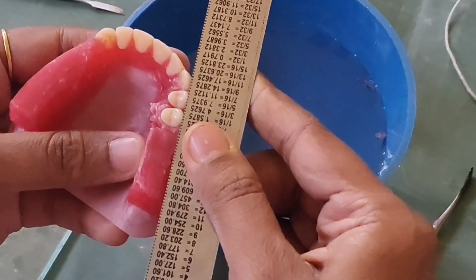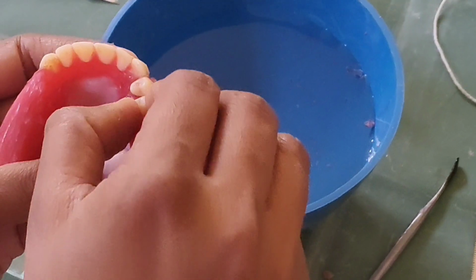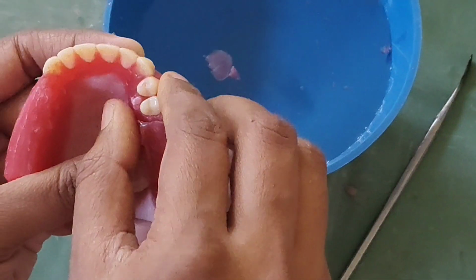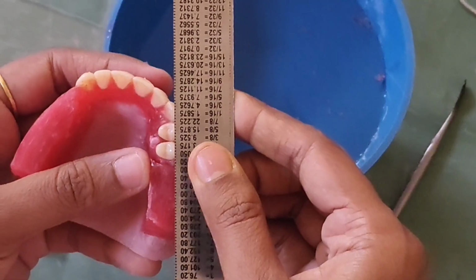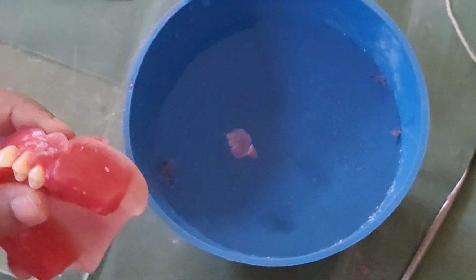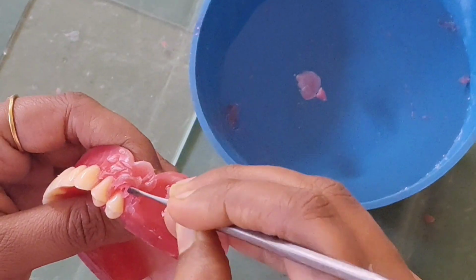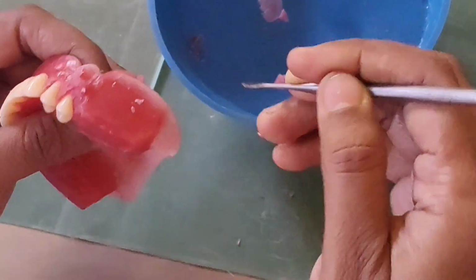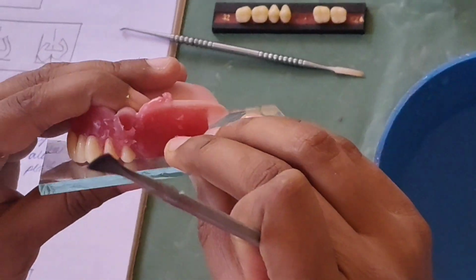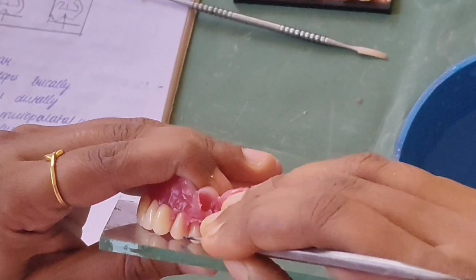I will check with this. For the second premolar, both the cusps will touch.